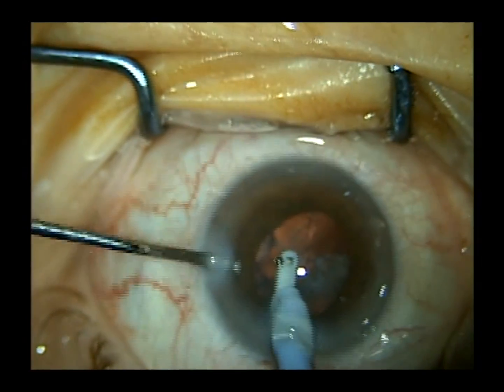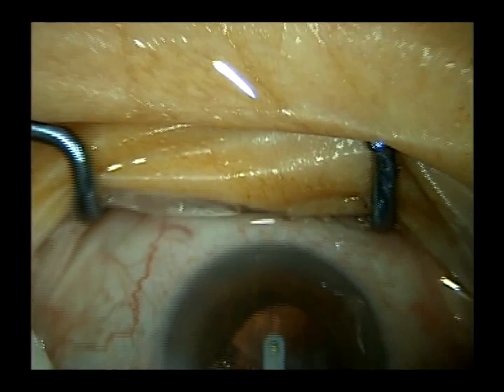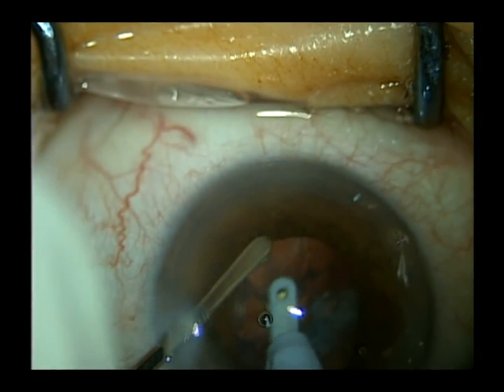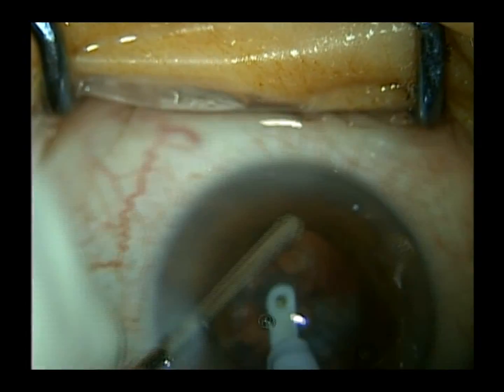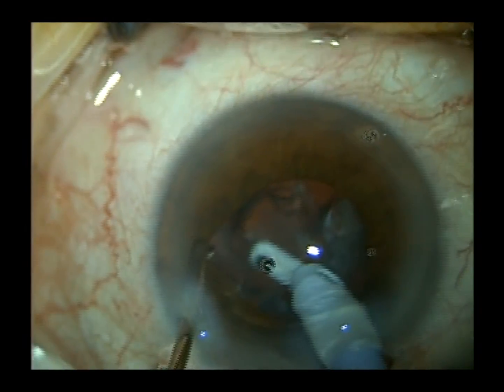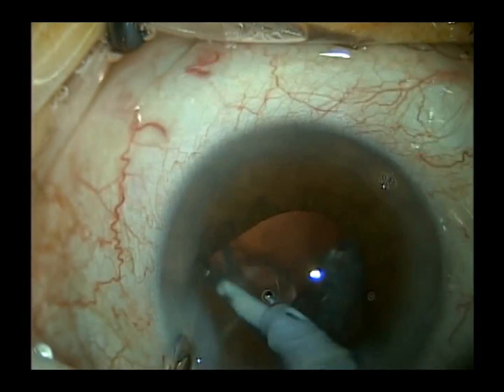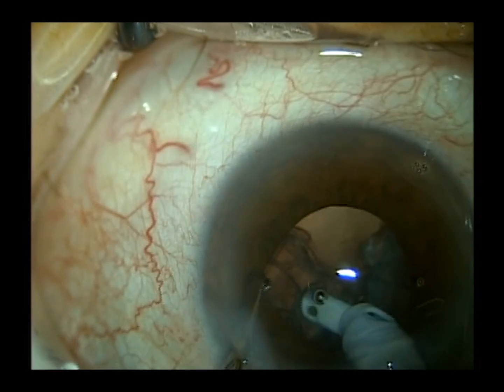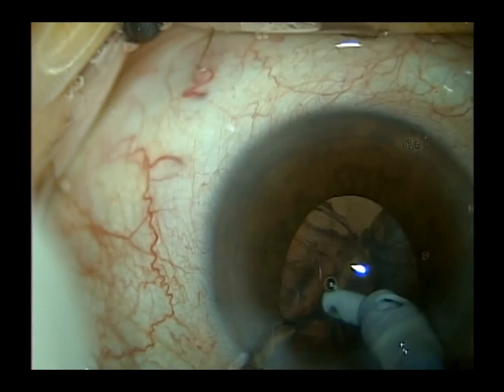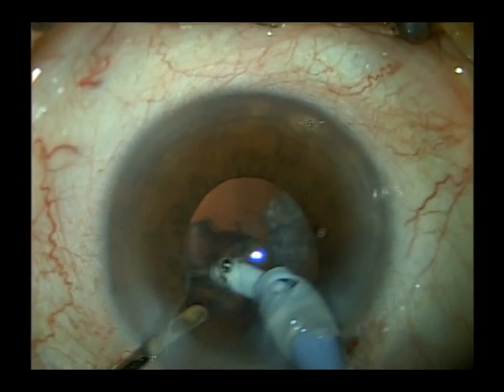And as I do IA, I know I'll have a hard time seeing the cortical remnants, so I'll use a collar button to essentially widen the pupil as I finish my irrigation and aspiration. This is just a simple way to gain exposure of the equatorial cortex in the presence of a small pupil without using iris retractors or other pupil expansion devices such as the Malyugin ring.